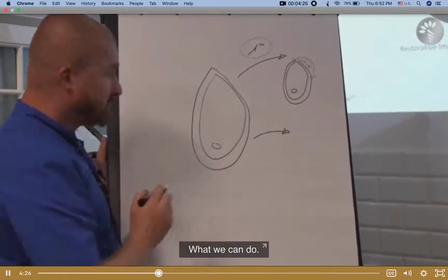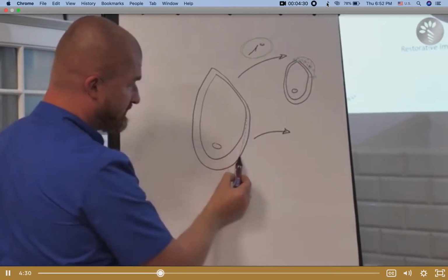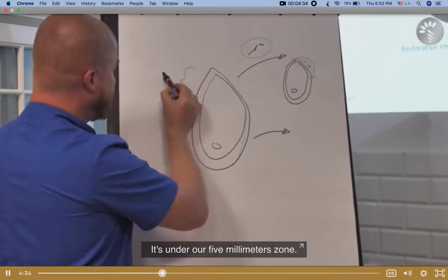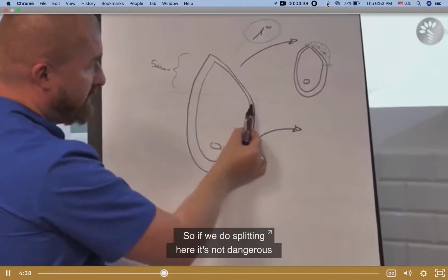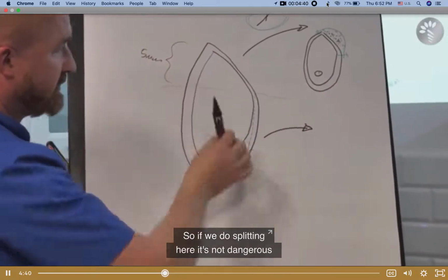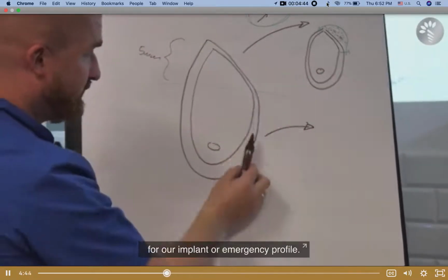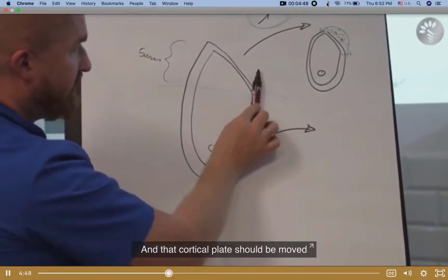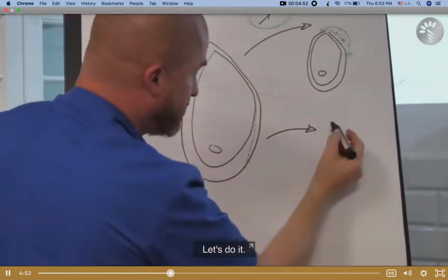Another safe method. What can we do? We can split the bone here. It's under our 5 millimeter zone. So if we do splitting here, it's not dangerous for our implants or emergence profile. And that cortical plate should be moved up and fixed by screw. Let's do it.